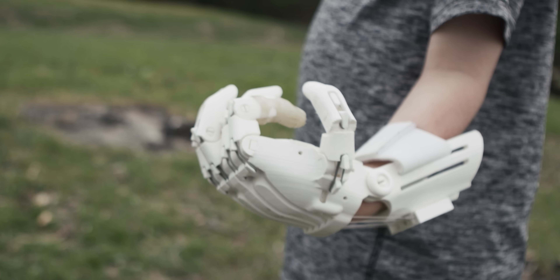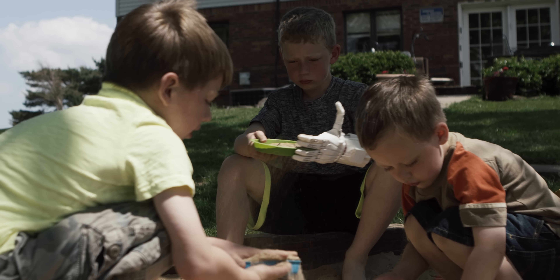Now that I have this hand, I can bring it to school and show it off. They think it's really cool, and I tell them that my dad made it.